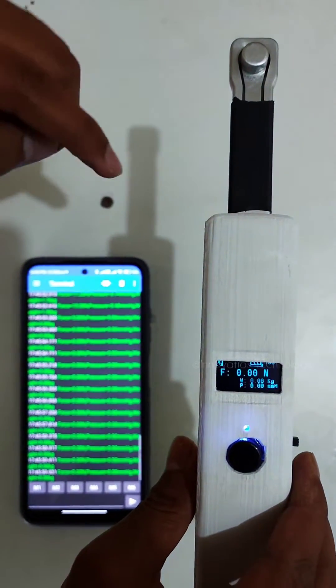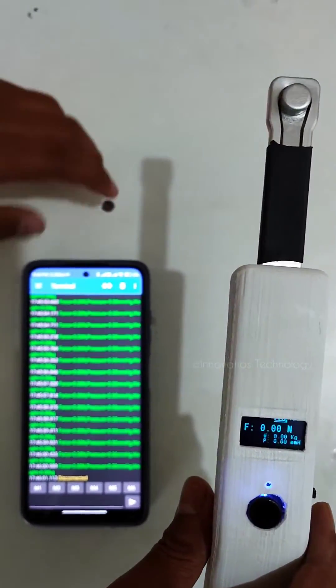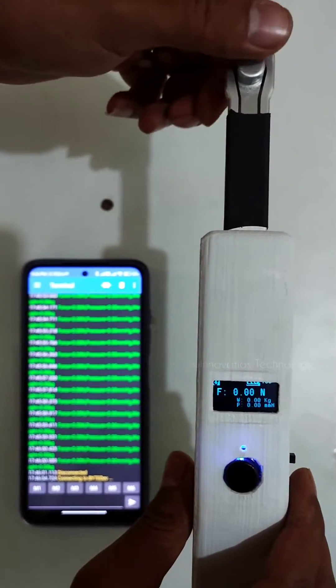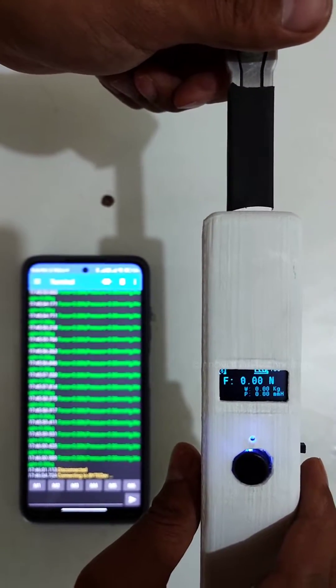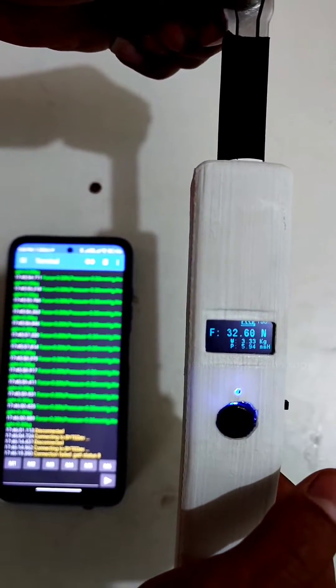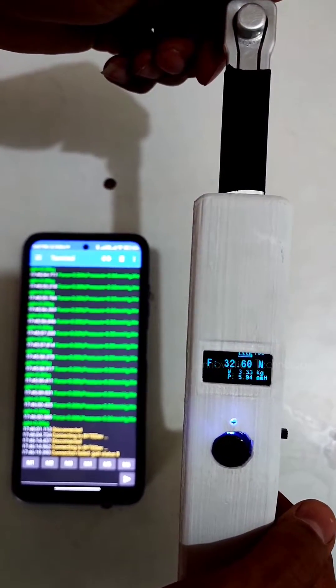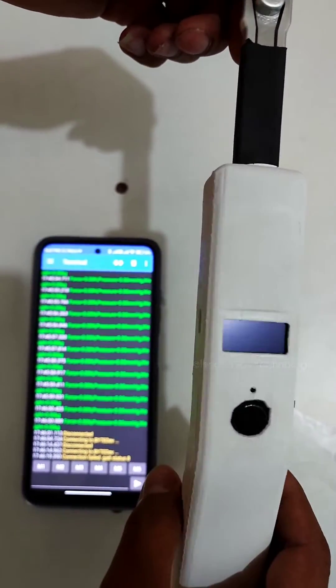When you disconnect, the Bluetooth icon will turn off. You can reconnect anytime and the data will start coming again. When you press the button a second time, it will show the last reading for 10 seconds and then go back to sleep mode.